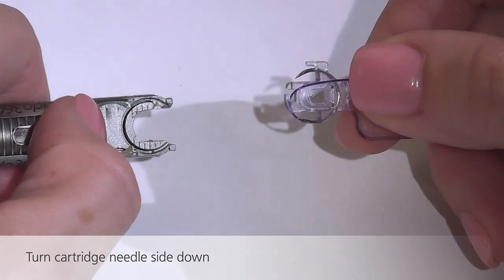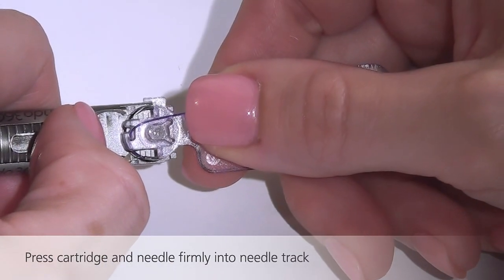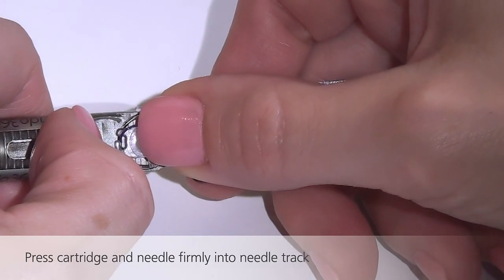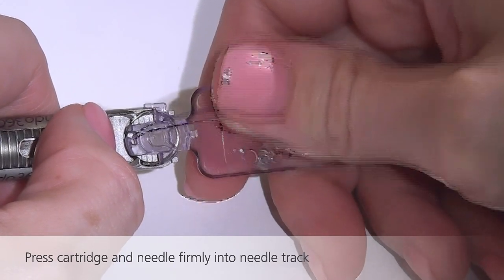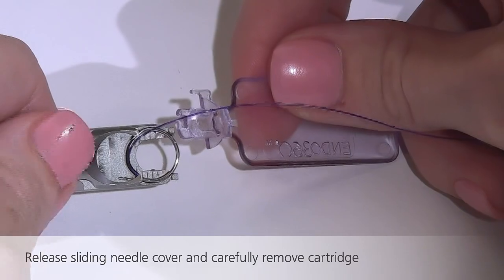Line the cartridge up parallel to the tip of the device and press the tip of the cartridge firmly into the needle track. The cartridge will fit snugly and securely. Release the sliding needle cover and lift the cartridge away from the device. The needle is now loaded.